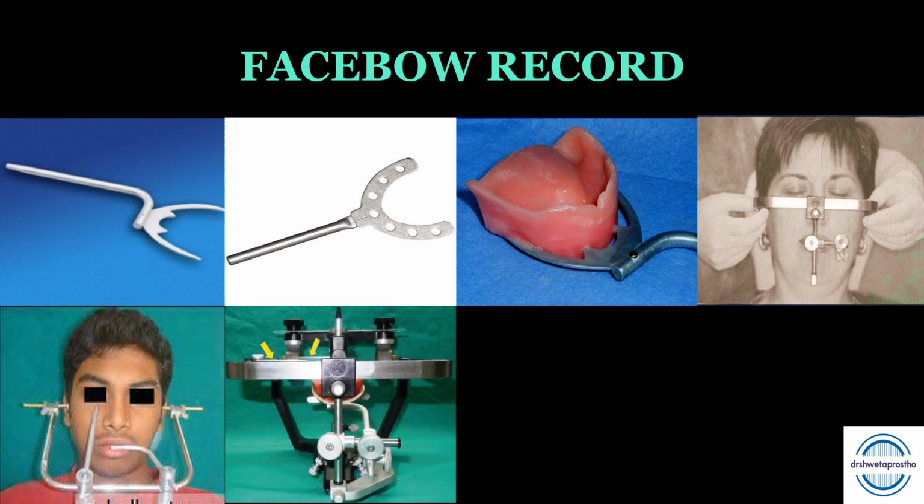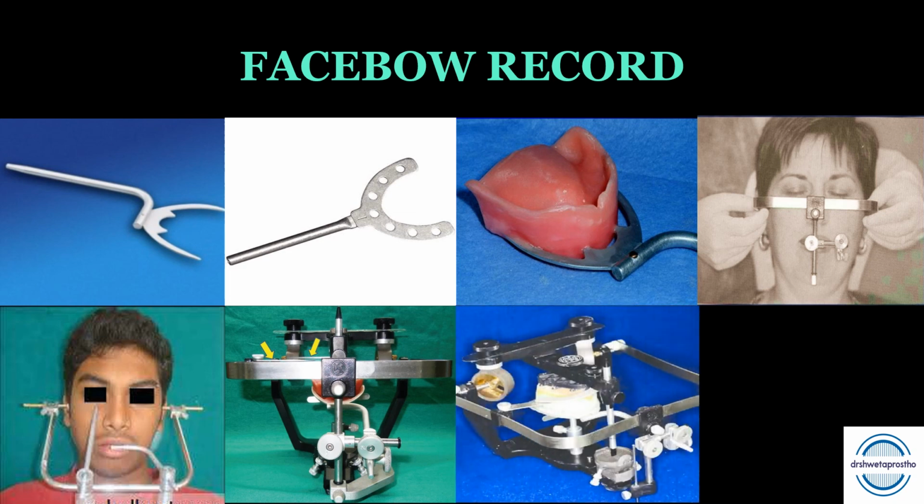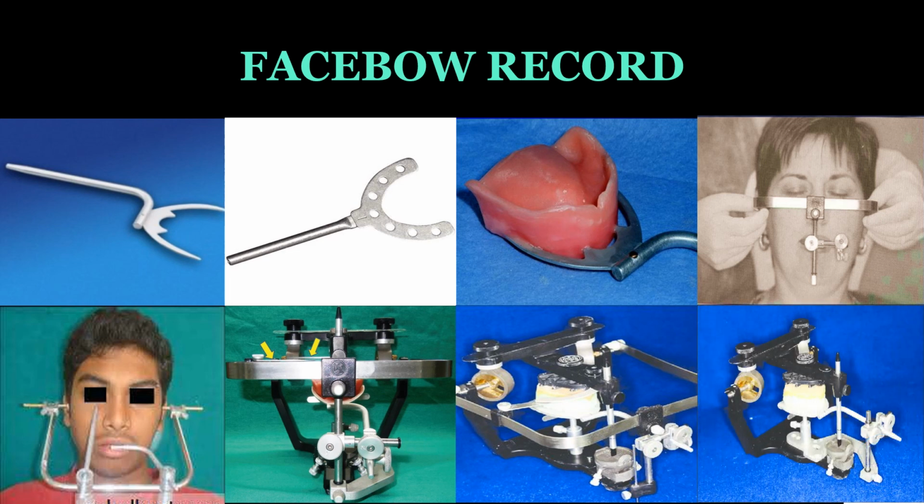Facebow assembly along with the bite fork is removed from the mouth and positioned in the articulator. Now this transfer can be direct using the whole Facebow assembly and moving to the articulator, or it can be an indirect transfer using a transfer jig. Okay, after this we will mount the maxillary cast with the articulator, followed by the mandibular cast mounting with the help of centric relation record.